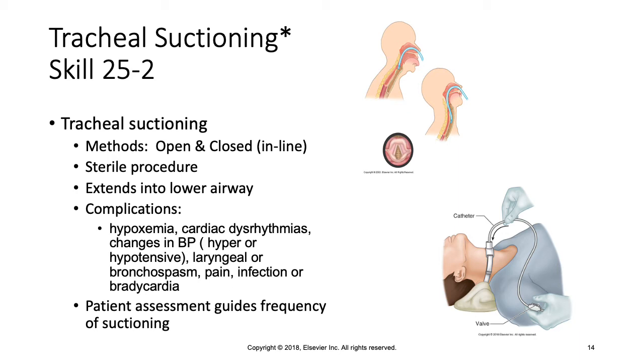Additionally, infection is another potential complication, and this occurs due to incorrect technique, not maintaining sterile procedure for the open method. And so it introduces microorganisms into the patient's respiratory tract, which is something we definitely want to avoid. And then bradycardia is another complication, and this is due to stimulation of the vagus nerve.